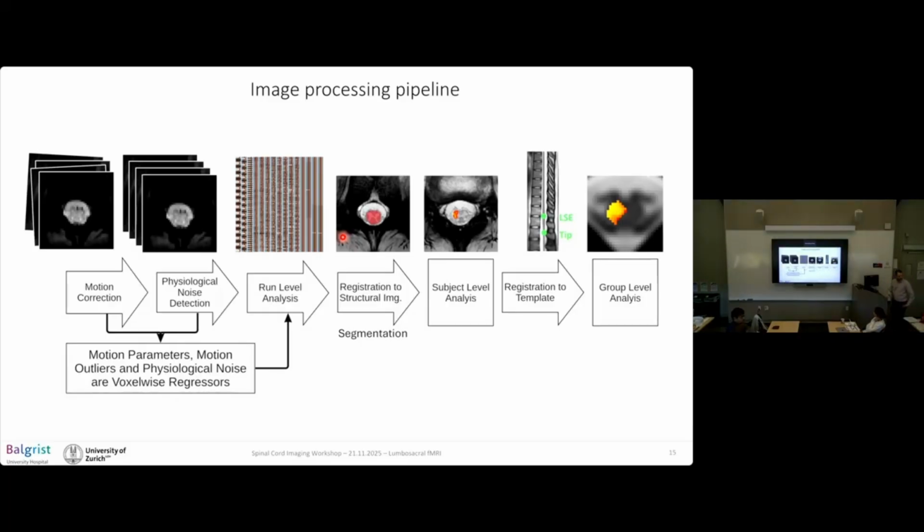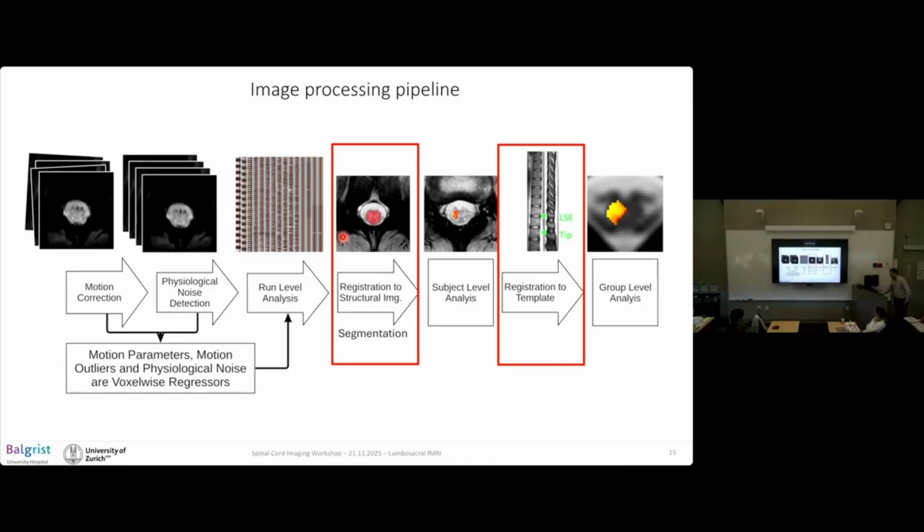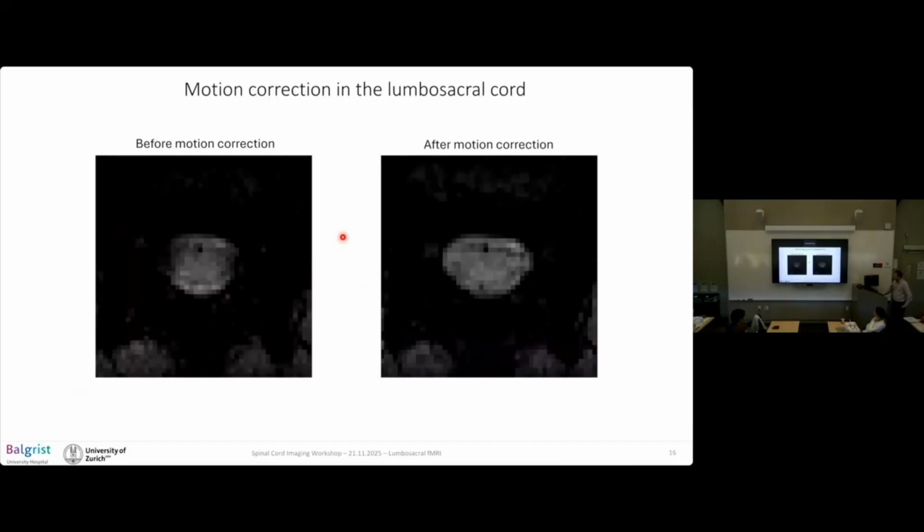Yes, so the image processing pipeline, I covered it in detail yesterday. So I'm only going to focus on the aspects which are more difficult in the lumbosacral cord, which are the segmentation and the registration to the template. But first, one example of motion correction.